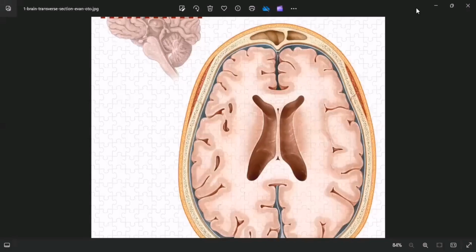Yes, so welcome to the second episode. We want to introduce head CT scans, and then, if time allows, we want to mention some pathologies. Okay.